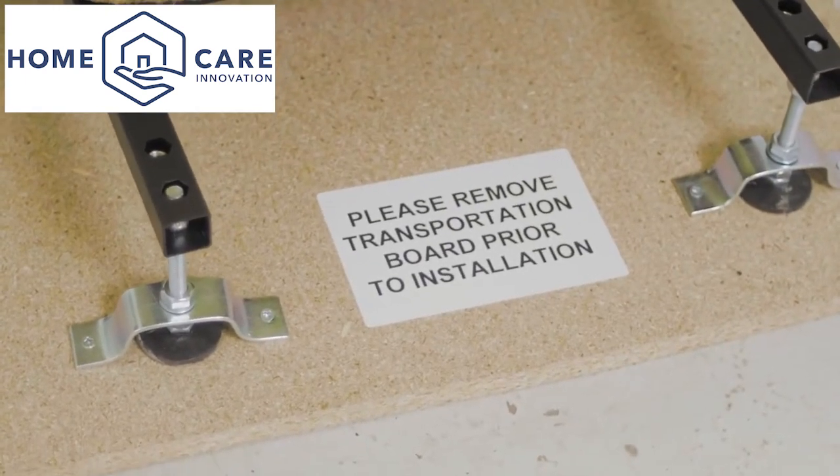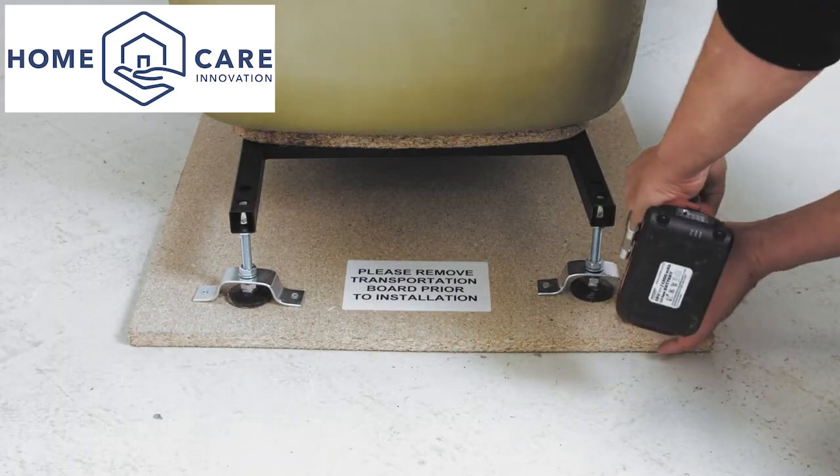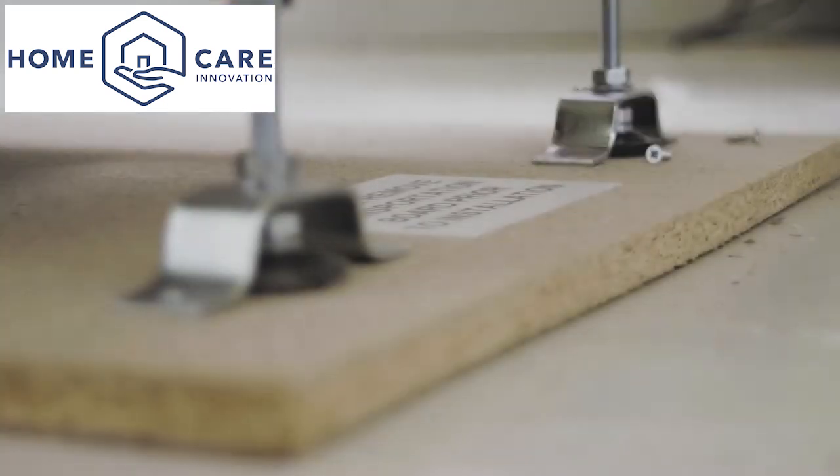Remove the bath from the transport board but keep the four slotted foot brackets as they are required for use later.